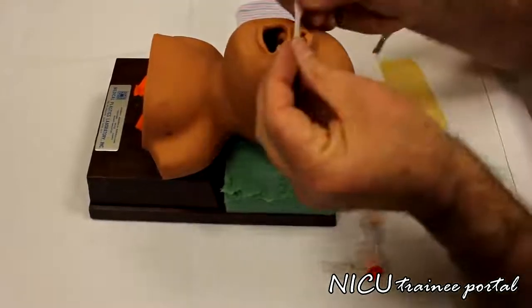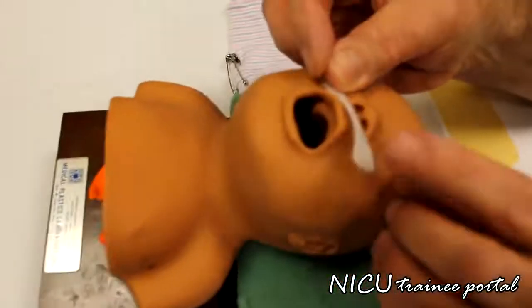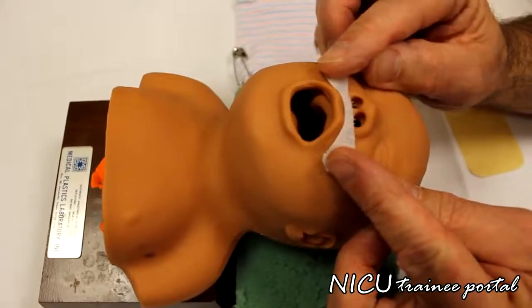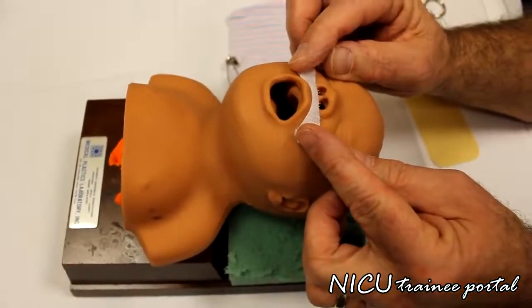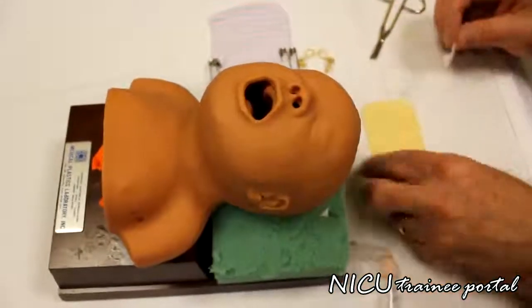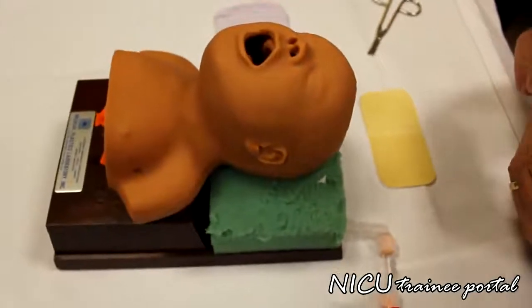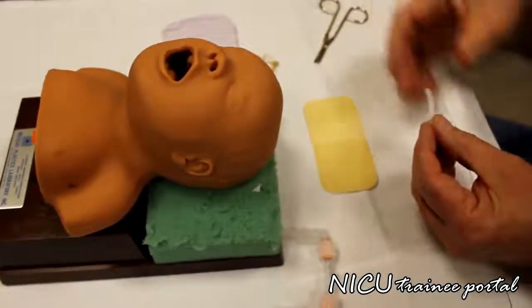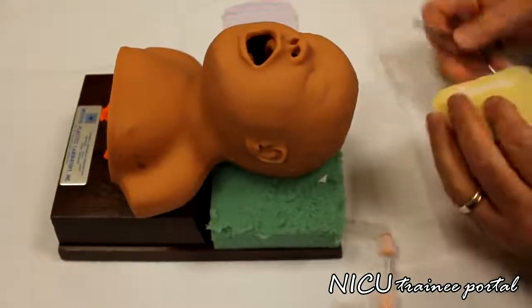See, it's going to fit just like that. If we were to stick this right on the baby like this, it wouldn't stay long. So we have to put a sub base of Duoderm extra thin. So how we do that is I take a piece of that and take the sticky liner off and stick it on here, and then I'll trim it all the way around.